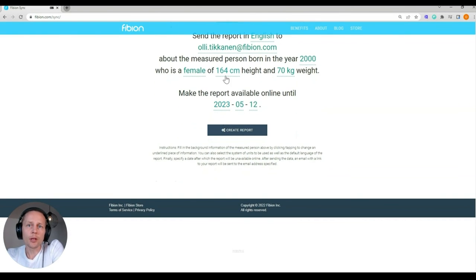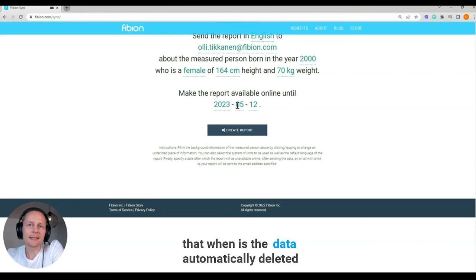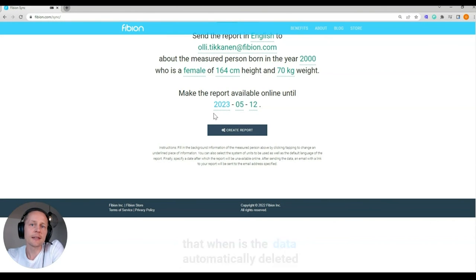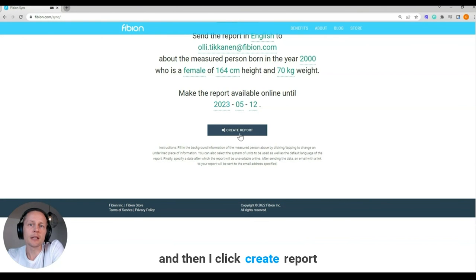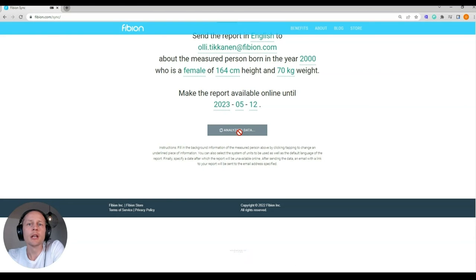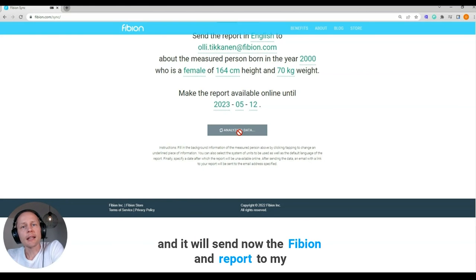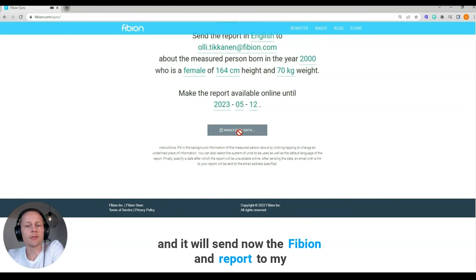You can also set when the data is automatically deleted. Then I click 'Create Report' and it will send the Fibion report to my email. All right, thanks a lot.